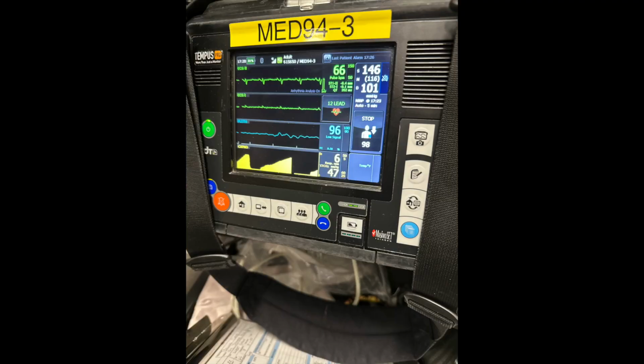Quite the contrary. Video laryngoscope increases first pass success. Bougie increases first pass success. Use them both, and it's really going to increase your first pass success. Okay, you drop your tube. Start ventilating. Don't ventilate too aggressively. See my ARDS video about that. Confirm tube placement. Using waveform capnography with end-tidal CO2 is the gold standard.